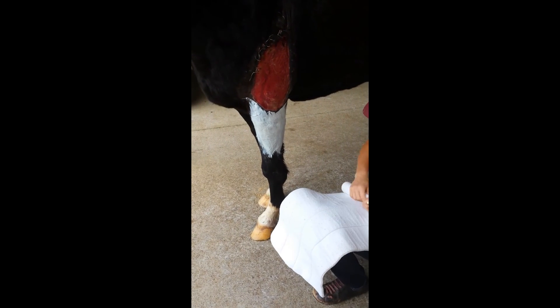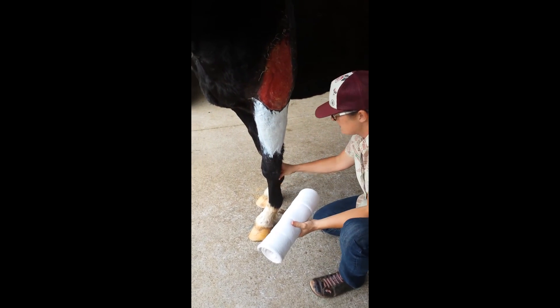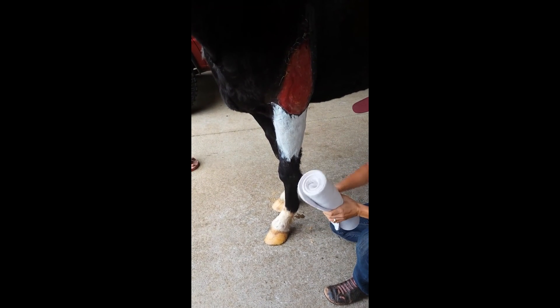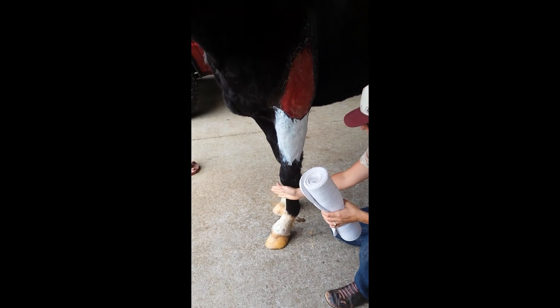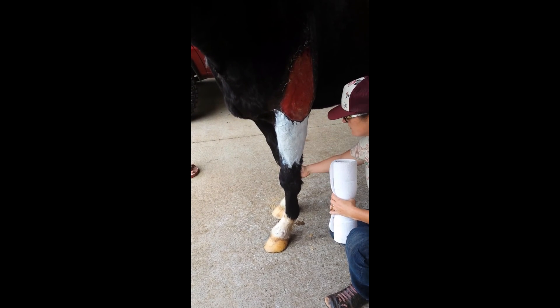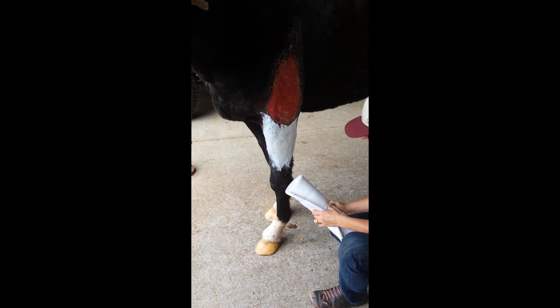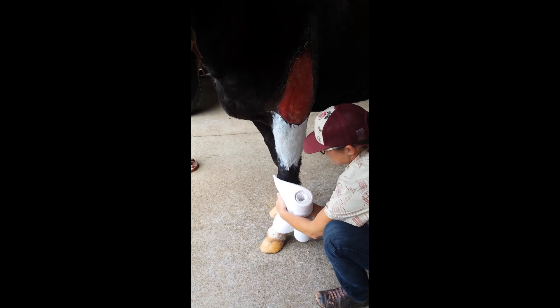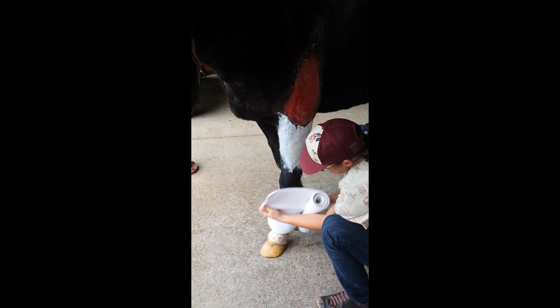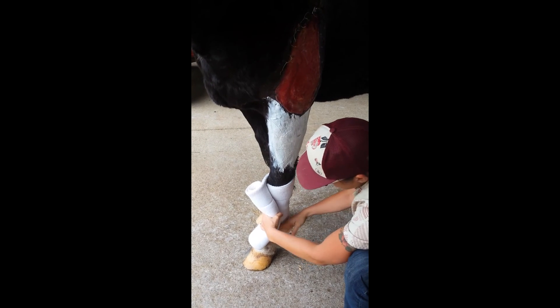These are quilted cotton wraps. This particular brand is called No-Bow because it doesn't bow the tendons in the leg. The way you want to wrap it is you follow the direction of the tendons. So on the left front, you're going to wrap from outside in, so counterclockwise. On the right side of the body, you would wrap the opposite direction — clockwise. I start with the wrap on the inside point of her leg, wrapping from knee to about mid-pastern, laying it nice and smooth, pulling it just tight enough that it lays flat.